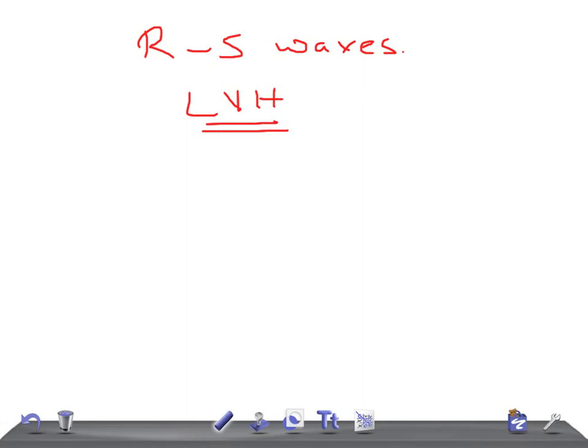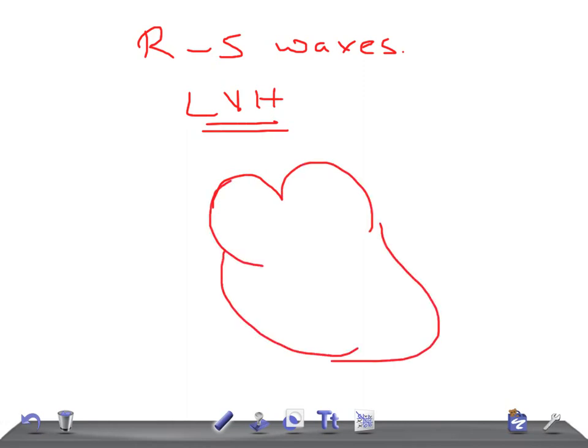So remember, now let me draw the axis over here so that it will be easy for you to remember every time. Now we have the leads. This is lead 1, lead 2, and lead 3. Then we have AVL.